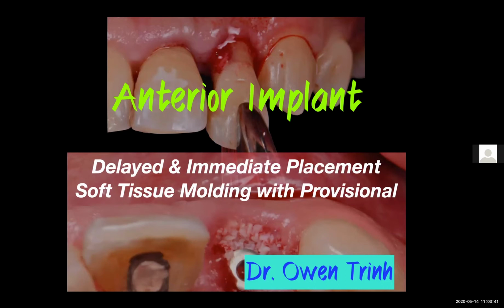From seeing referral and walk-in patients with existing anterior implants, from the time of my residency to now, I have consistently found that on average, in 4 out of 10 patients, incorrect anterior implant position creates less than ideal surgical and restorative outcomes, as well as future restorative complications when we try to rectify the situations.